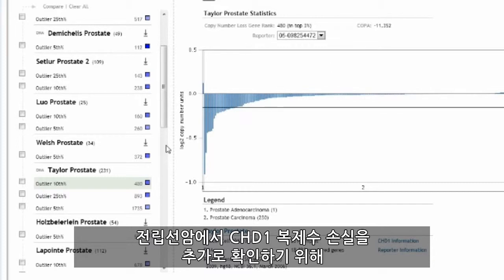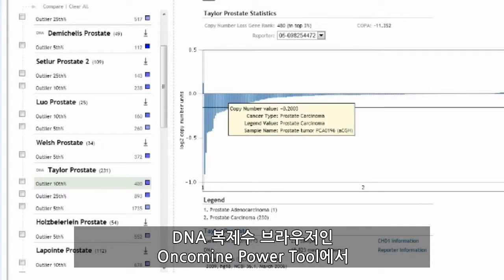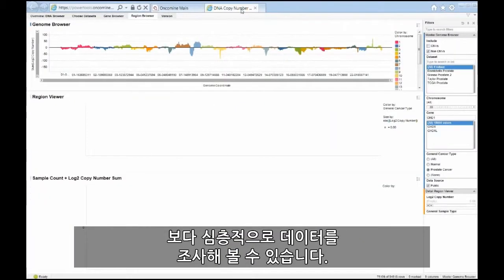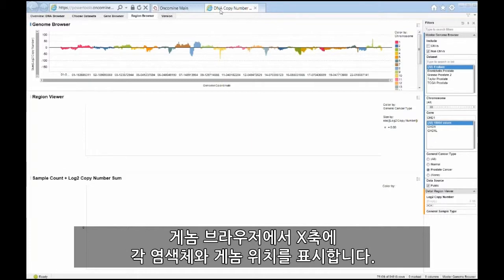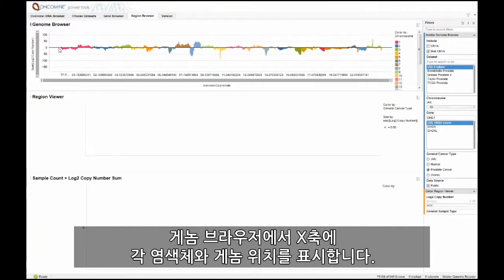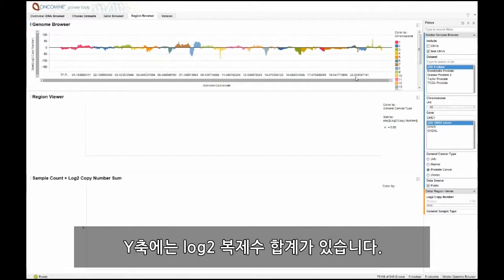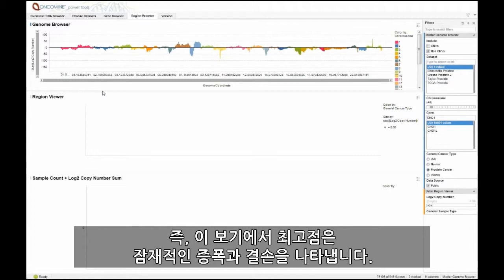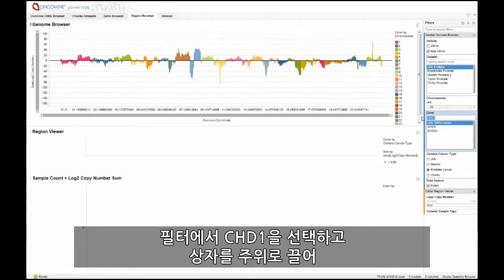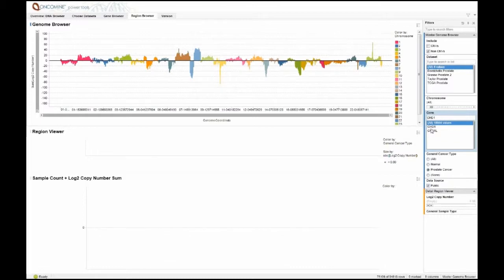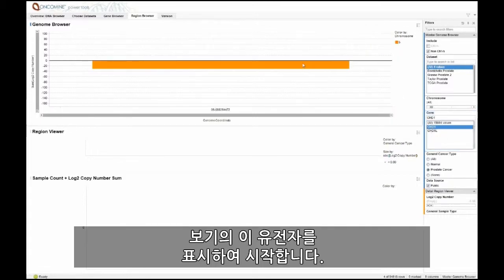To further confirm CHD1 copy number loss in prostate cancer, we can explore the data in more depth in the Oncomine Power Tool, which is the DNA copy number browser. Here we've selected prostate cancer datasets and are viewing in the genome browser each chromosome and genomic position on the x-axis. On the y-axis, we have the sum of our log2 copy number, with peaks representing potential amplifications and deletions. We can begin by selecting CHD1 from the filter and marking that gene in our view by drawing a box around it.